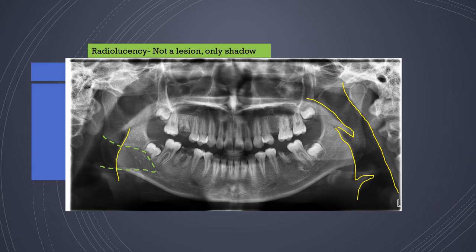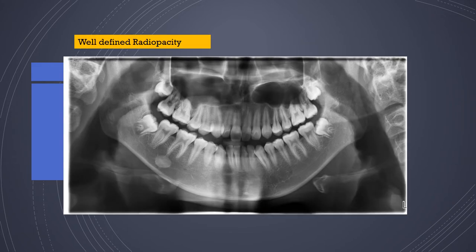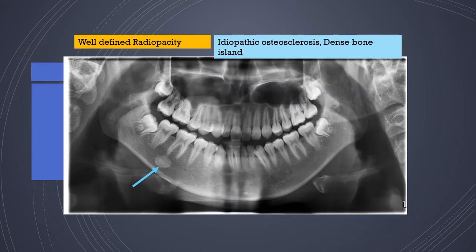Air shadows can be mistaken for pathology. Well-defined radio-opacities, like the one seen here, look benign and harmless — this happens to be idiopathic osteosclerosis, also known as a dense bone island. There is no treatment indicated for this and it is simply left as is.